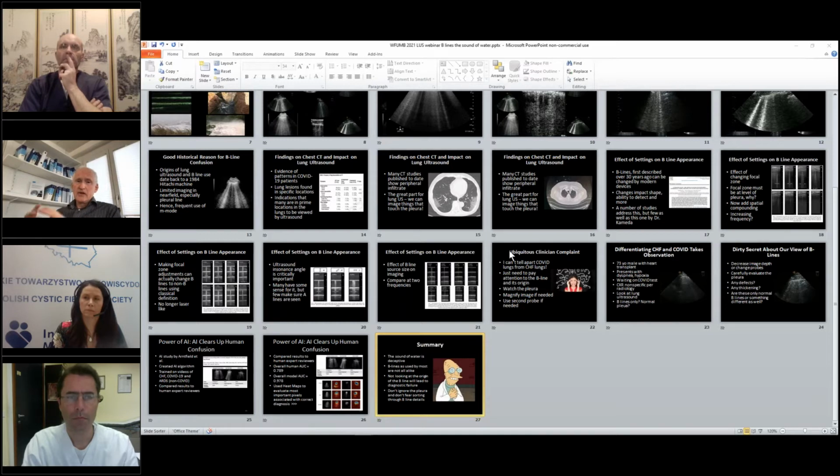In addition, if we have a tumor, a neoplasia, then we have to be aware that there is the early pulmonary artery vascular supply, and then we have the bronchial arterial vascular supply, and you can differentiate between a subpleural consolidation which is vascularized by pulmonary artery and by later on bronchial artery, and this can be nicely depicted.